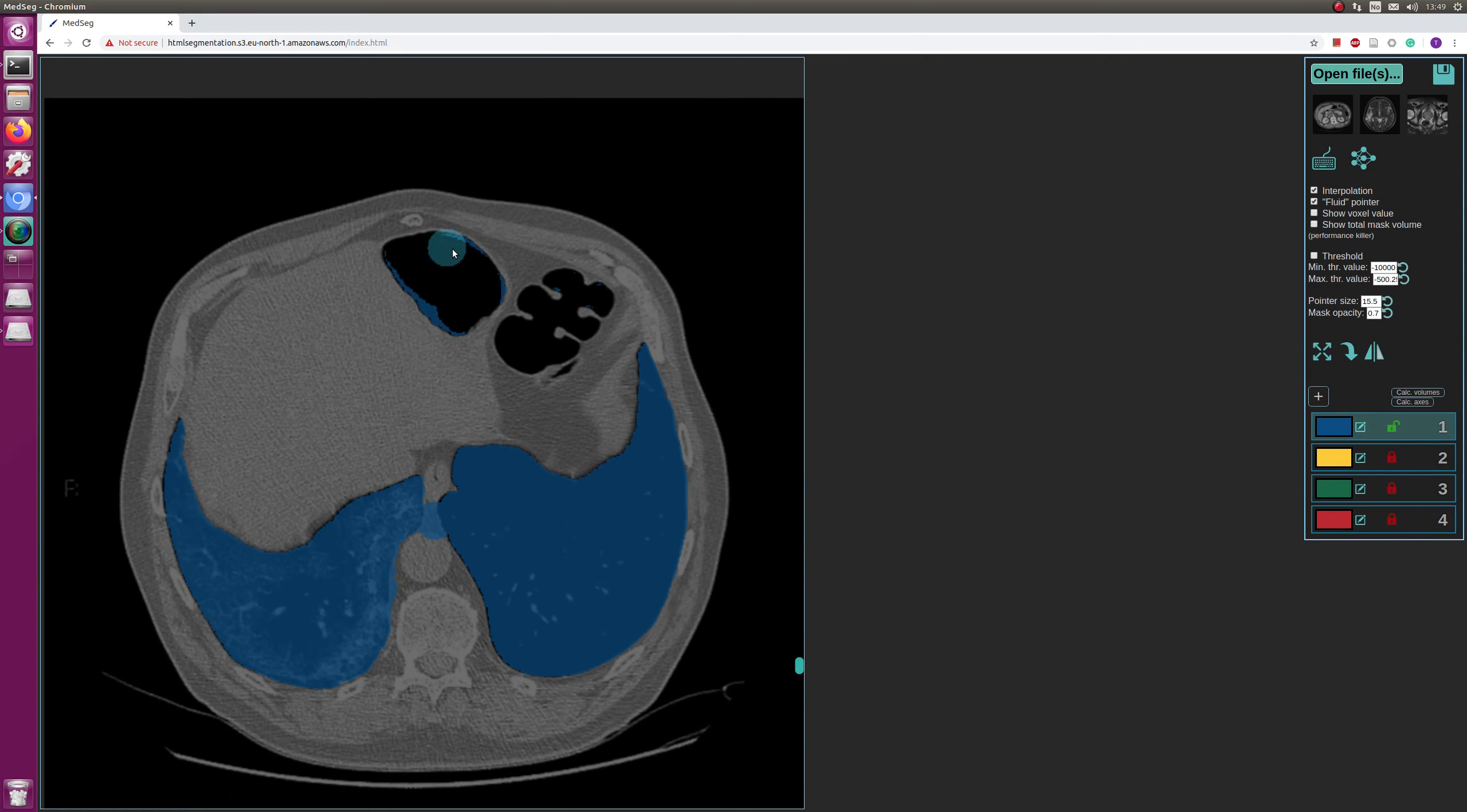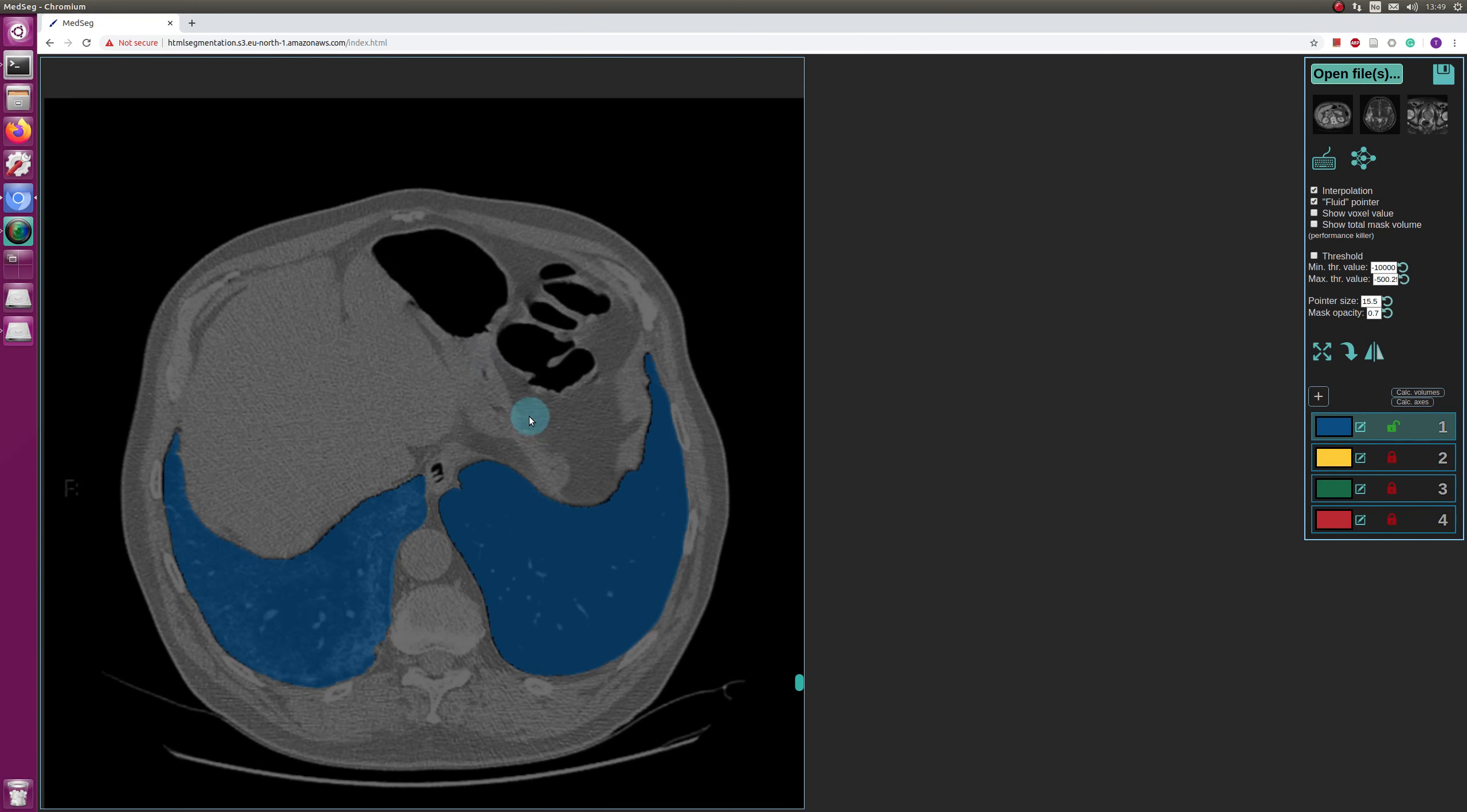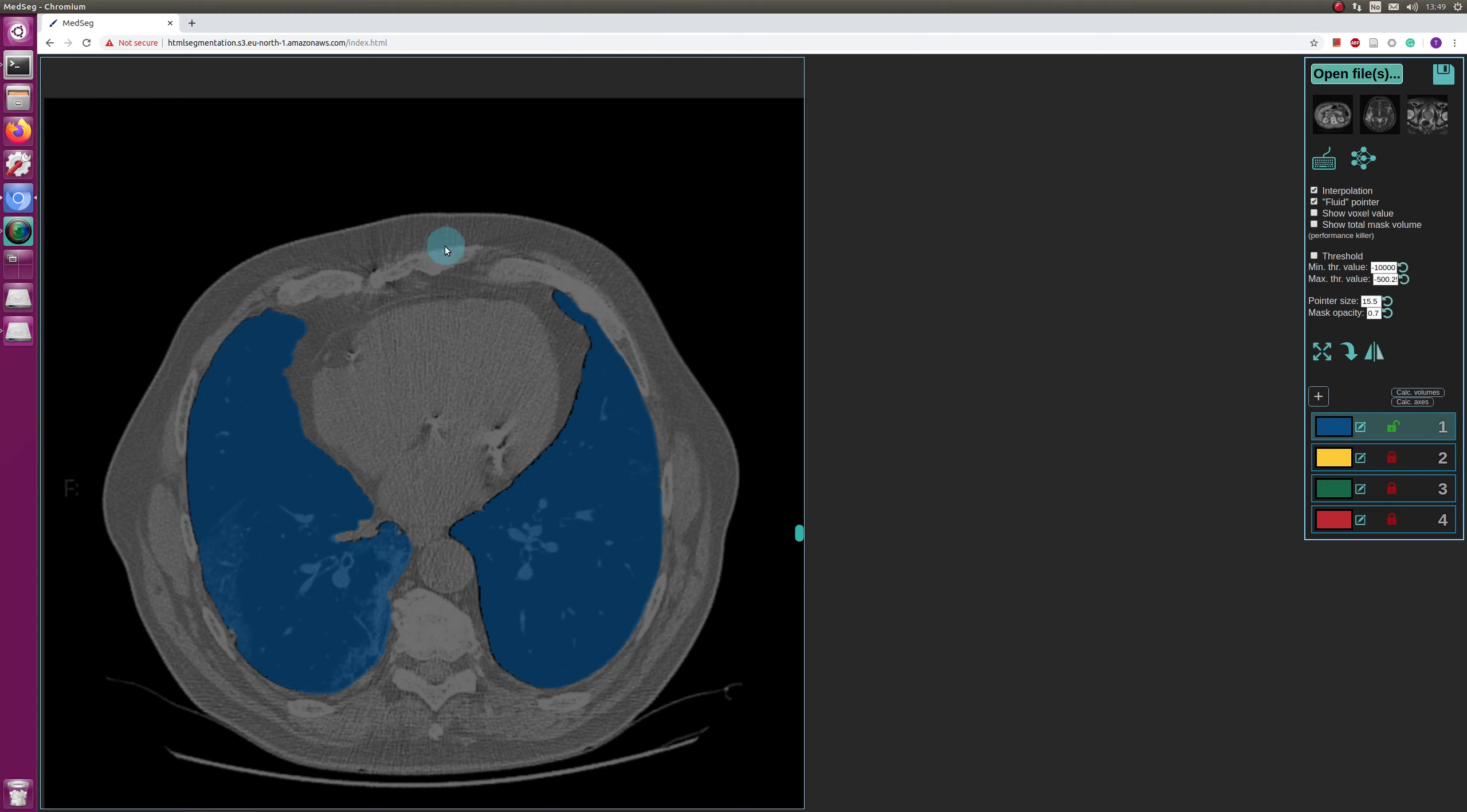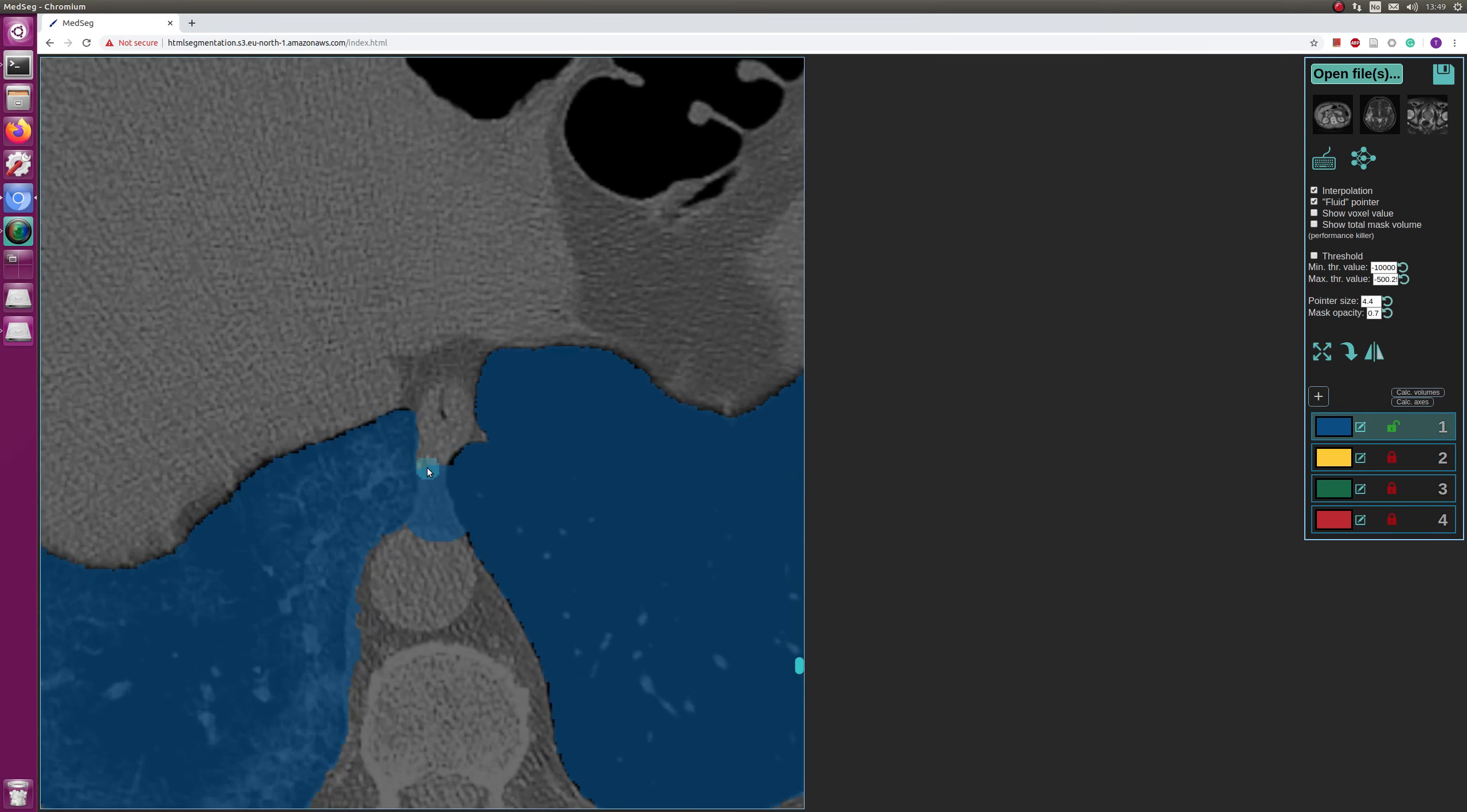And you should see that these all disappear. So what I do is I press shift and the asterisk, and everything disappeared in three dimensions, so also everything that was positive down there. And I can just show you once more. If I paint here, you see these parts are not connected in this slide, but they're connected in another slide. That's why they don't, the other lung doesn't disappear, but everything else goes away. And now we just have to remove that connection.